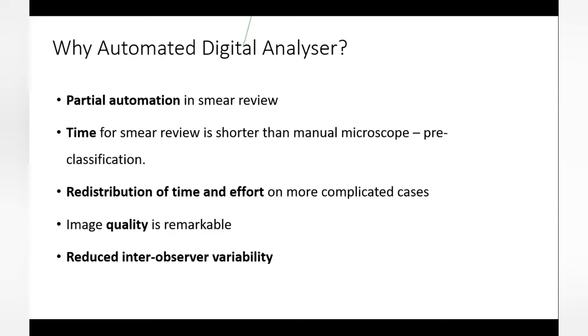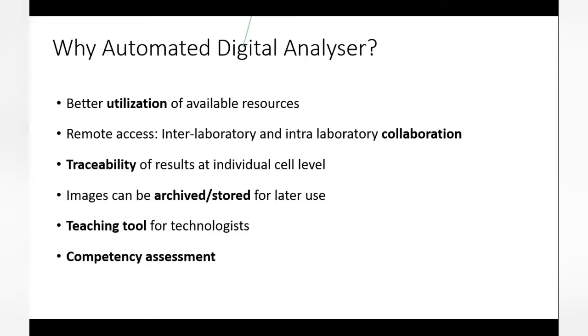It depends on the type of software that you use. And there is a reduced inter-observer variability, better utilization of available resources, like I just mentioned. Remote access, I think here is one of the most important things about using a digital platform, is you can collaborate better with your colleagues and experts. And the traceability of results at every individual cell level is available.